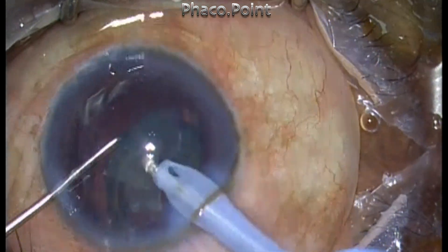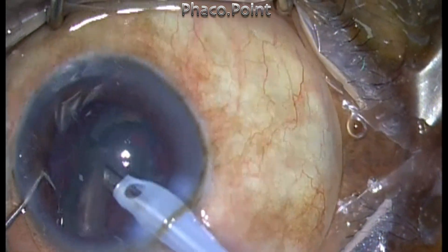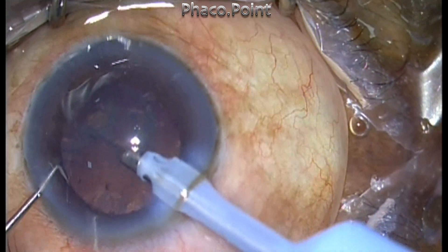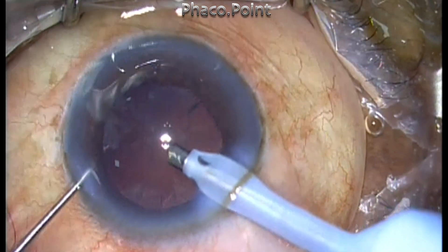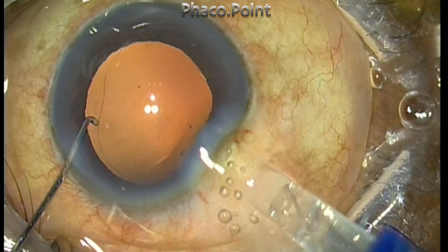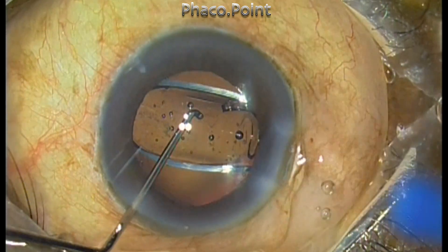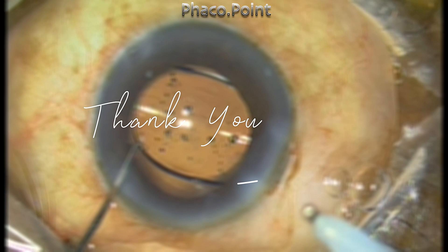In this patient with a grade 5 nucleosclerotic cataract, I have not even used a dispersive viscoelastic like Viscoat — I'm just using 2% hydroxypropyl methylcellulose, and this is adequate to protect the endothelium. Please try to create smaller size fragments when handling larger grades of cataract. The rule of thumb: for grade 2, create four fragments; for grade 3, about six; and for a very hard cataract, about eight fragments. Do that and you will end up with clearer corneas. Thank you for your attention.